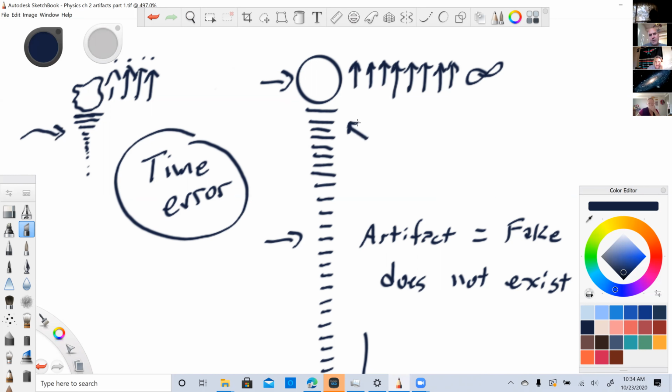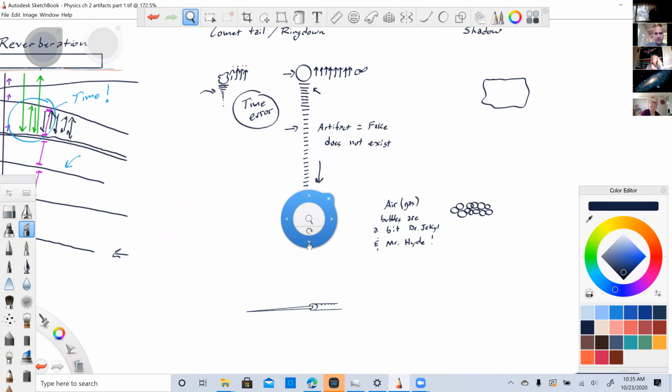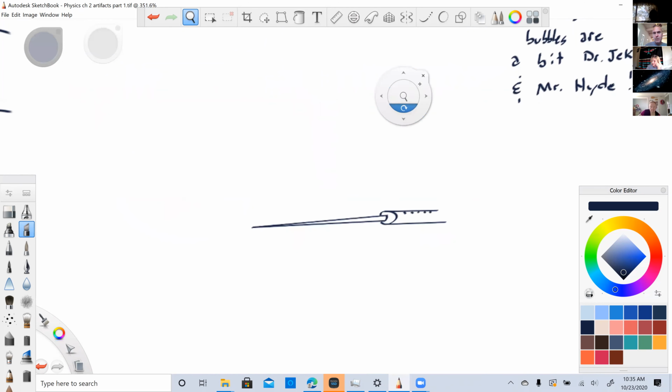This helps me identify when I see something like an air bubble where it shouldn't be. If I see a ring down artifact, I just remembered, I forgot I had another picture here for ring down. Hypodermic needle or a foreign body, or any kind of metal or anything that would ring, we see coming off. And oftentimes we help guide needles into tumors or cysts or whatever, maybe a blood vessel.